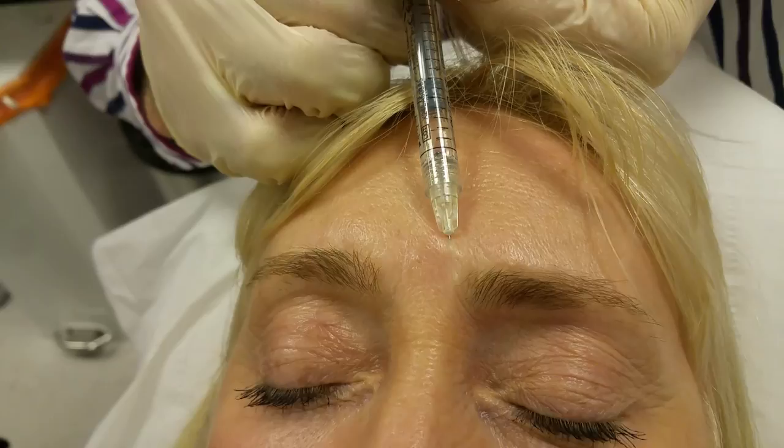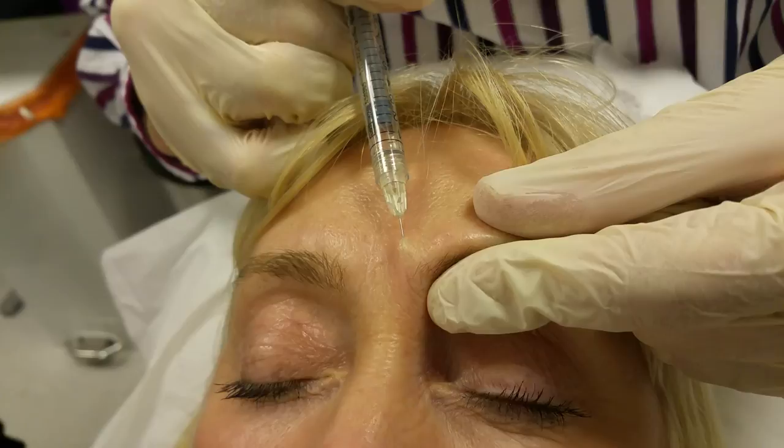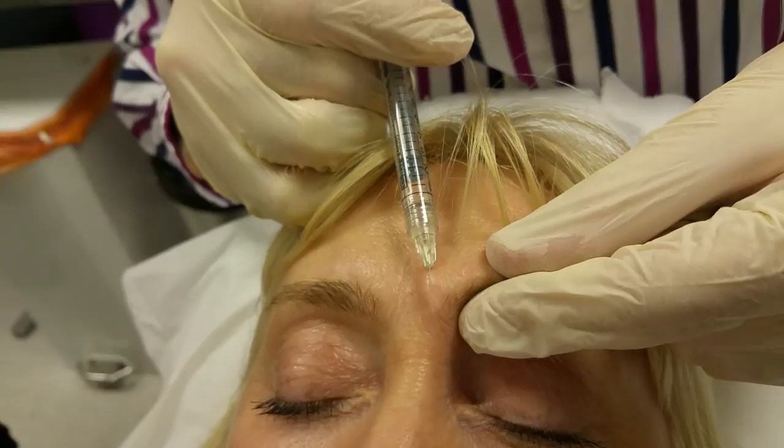I'm now aspirating and checking — there's no blood coming out. At this point I can compress the artery with a nice firm squeeze, and now I'm going to fill 0.05ml with a nice low-pressure injection. I'm going to go in one more time and repeat that before coming all the way out: aspirate, depth check, compress the artery, fill going backwards.